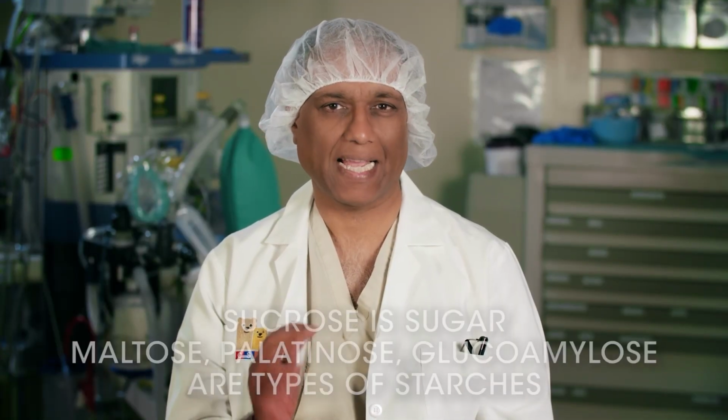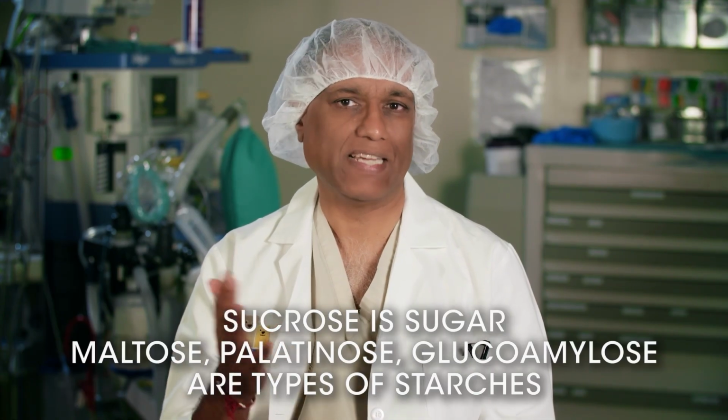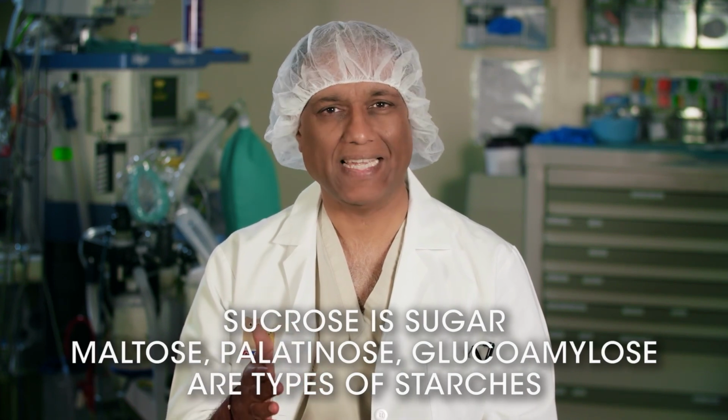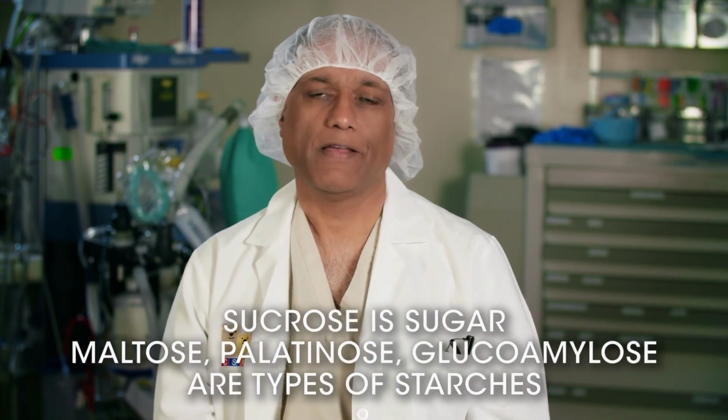So when we do an endoscopy, we will go into the small bowel and take biopsies for disaccharidases. These can measure up to 5 enzymes, depending on the interest. One is lactase, then sucrase, maltase, palatinase, and in some labs, glucoamylase. Independently and combined, these are all conditions that affect your carbohydrate malabsorption.